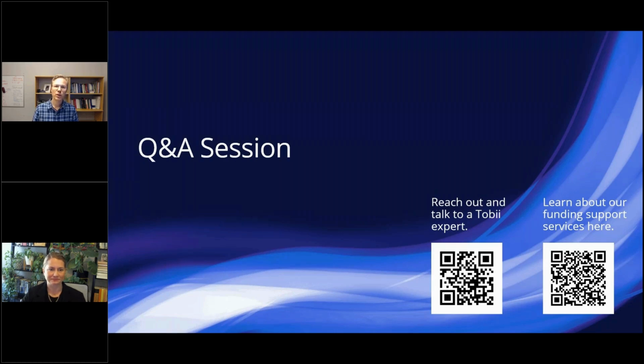If I could have a wish list, it would maybe even be better to separately track the upper and lower eyelid, and also where the pupil is in the eye image. Then you can also apply the measures I showed you in the table in the beginning.